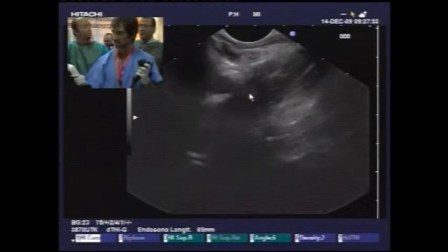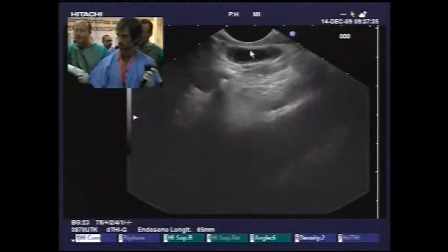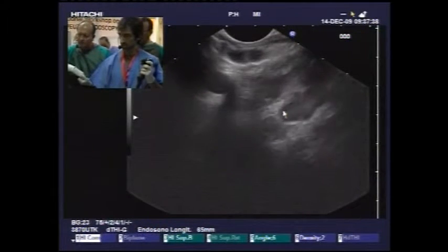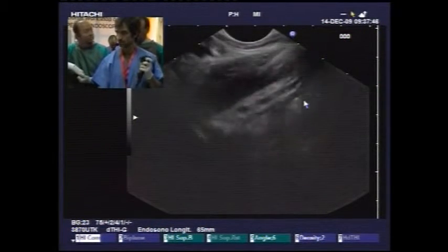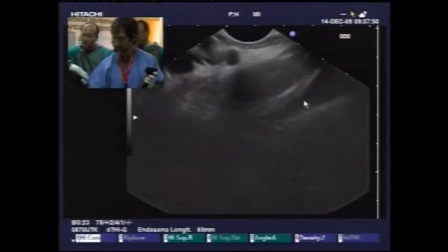You can see white flaky material also coming out on the screen. This is often an indication of chronic pancreatitis; the fluid has this appearance. Are you seeing that on the endoscopy screen? Yes, we can. Pancreatic necrosis. Exactly. I think you're right.